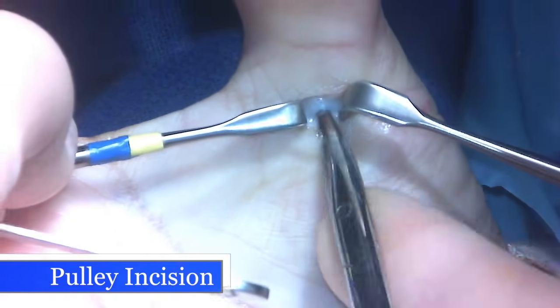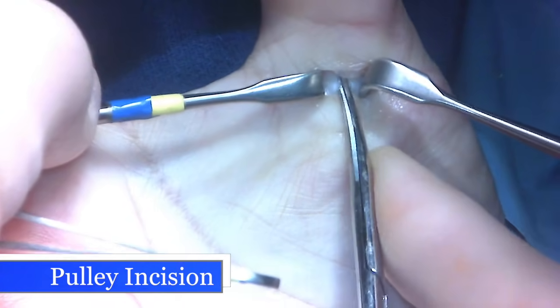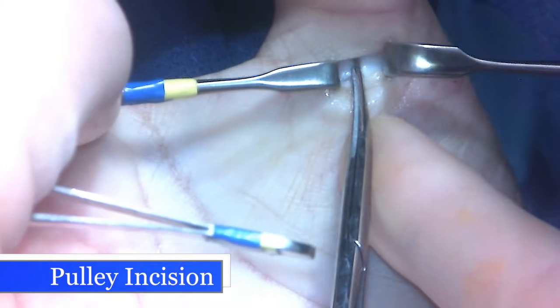Exposing the tendon — showing the tendon right here — and then I'm going to snip the pulley lengthwise to release the constricted band impeding the tendon from moving fully.